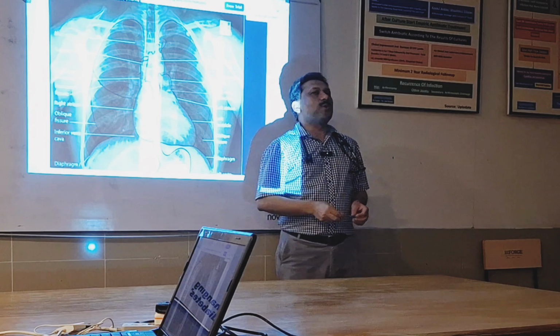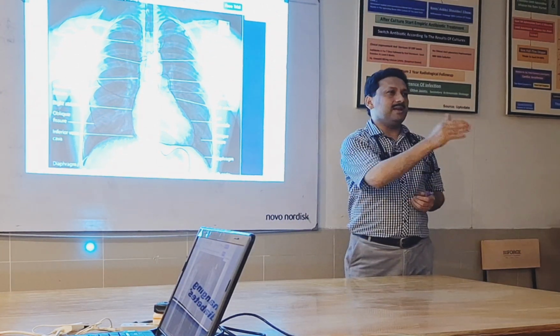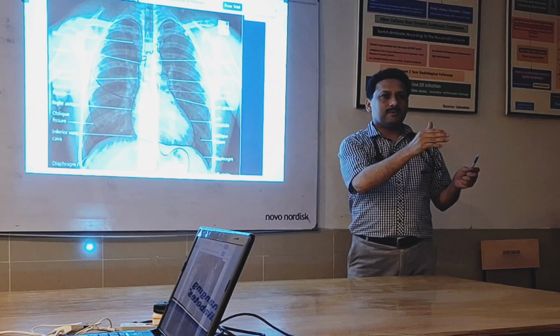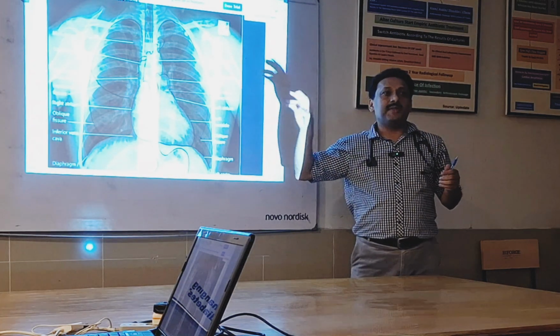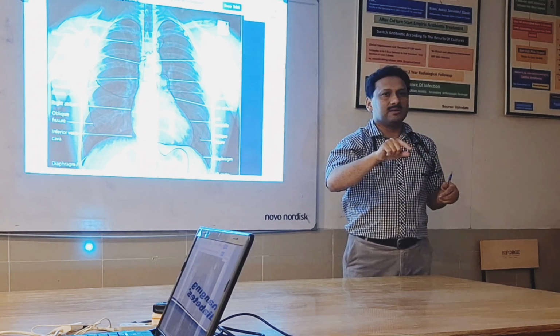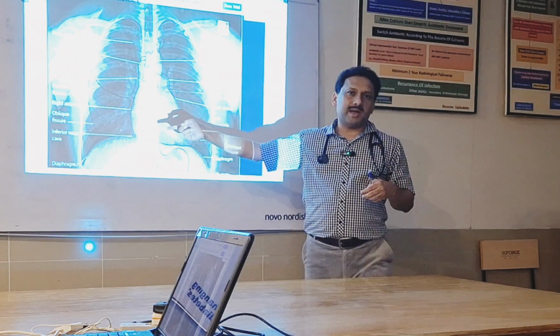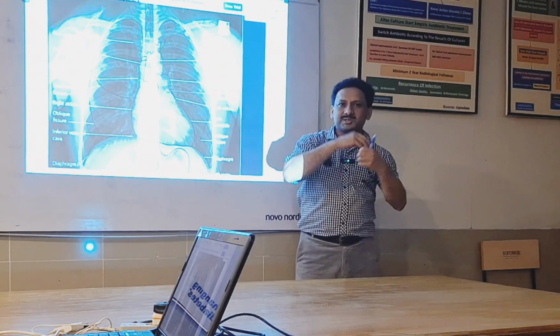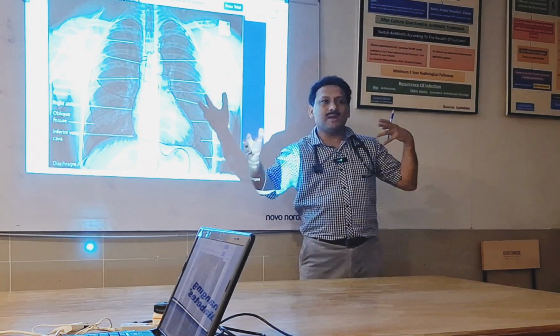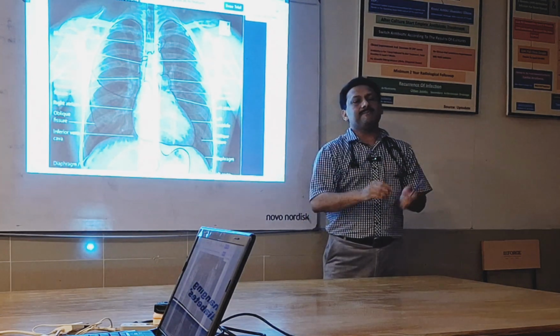So what can be the problems you can see? A, B, C, D, E, F, G, H. Why are we supposed to focus that way on an X-ray? That way we won't be forgetting anything. But if somebody asks you to comment on any problem in the X-ray, then your comment shouldn't be like that, where you just keep on saying A for airway, airway normal, B for bone and bone normal. You would not be commenting like that.